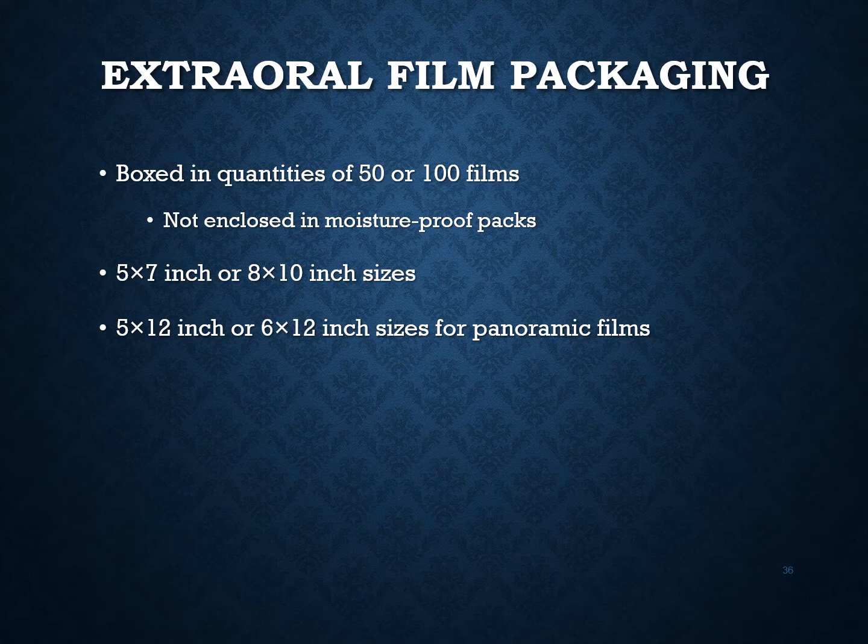Okay, so extraoral film packaging. They usually come in a box of about 50 to 100 films. They are not enclosed in moisture-proof packs. Why are they not enclosed in moisture-proof packs? Because they don't go in the patient's mouth. They come in either a 5 by 7 inch or an 8 by 10 inch size, which are for the cephalometric, by the way, and the 5 by 12 inch or the 6 by 12 inch sizes for the panoramic films.